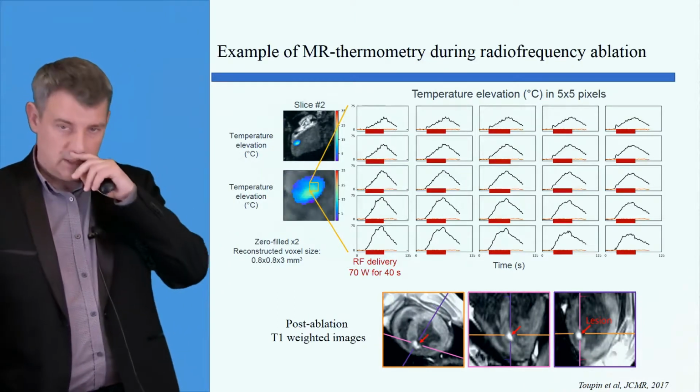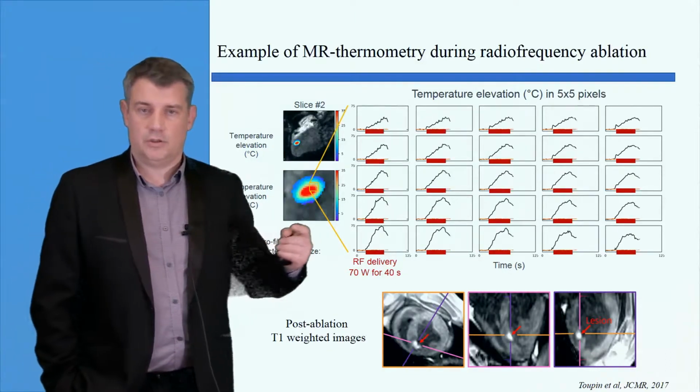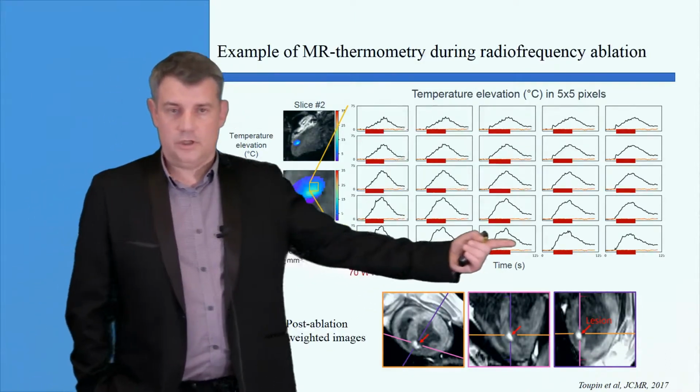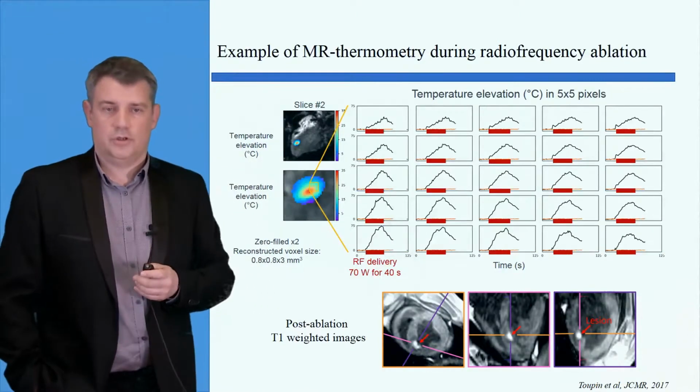And then using this technique, you're able to map the temperature change dynamically during radiofrequency ablation. And you can plot, for each pixel in this heated area, the temperature evolution in time.